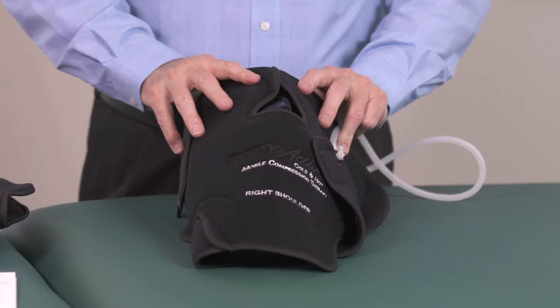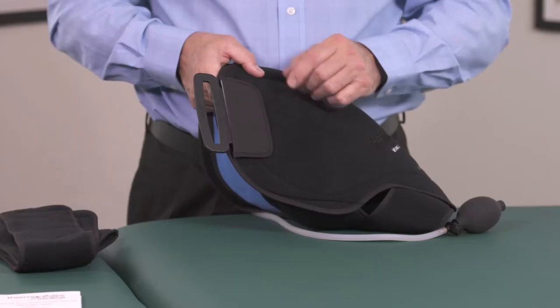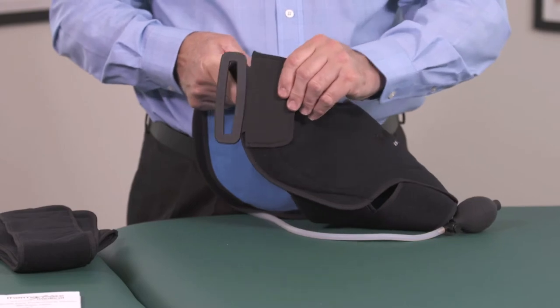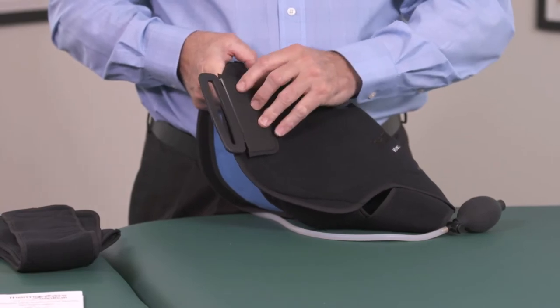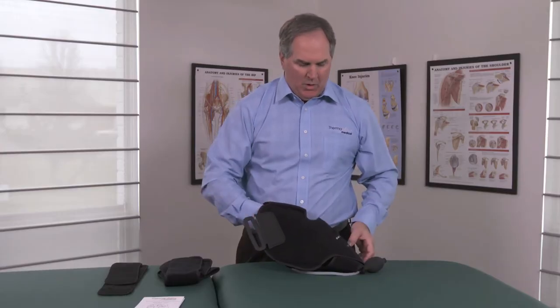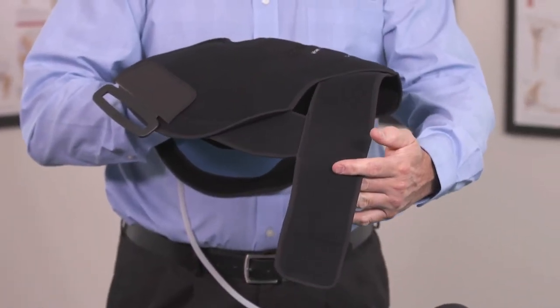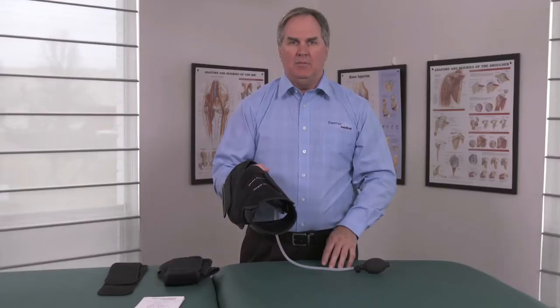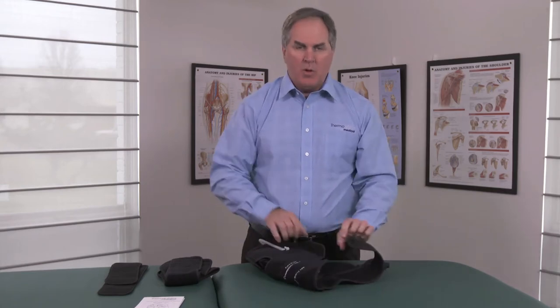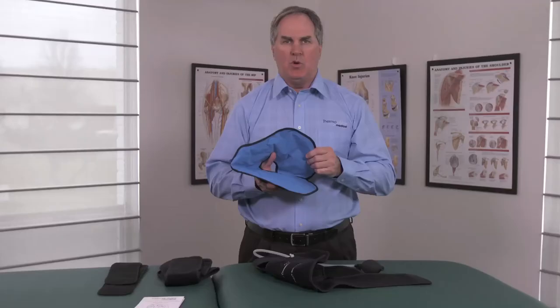Our shoulder system comes in right and left for easy patient fitting. Some of the key features on our shoulder is our floating D-ring, which can be placed in numerous positions offering the patient a more customized fit. We also have a new and improved Y-strap system which the patient can easily attach and pull across using one hand. Also part of the system is our gel pack, specifically custom designed for the shoulder system.